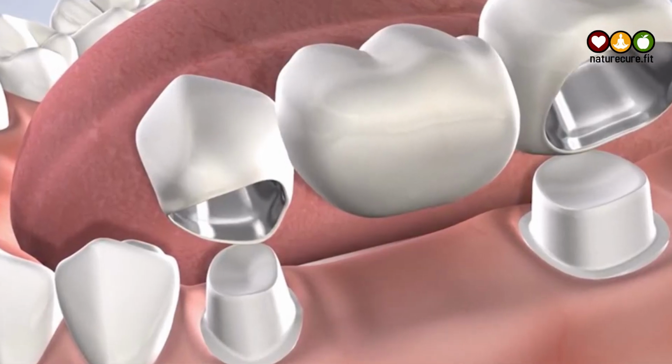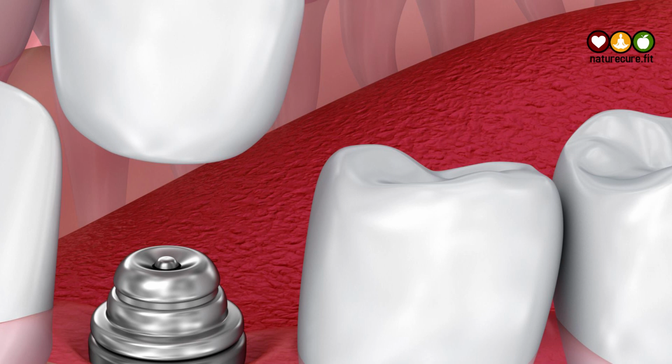replace the teeth. In this artificial replacement procedure, we have two options for a fixed one. One is shaping the neighboring teeth and the other is taking support of the underlying bone. Taking support of the underlying bone is called implantology, where we place an implant in the bone and we have to wait a minimum of 4 to 6 months for the bone to come and adhere to the implant.